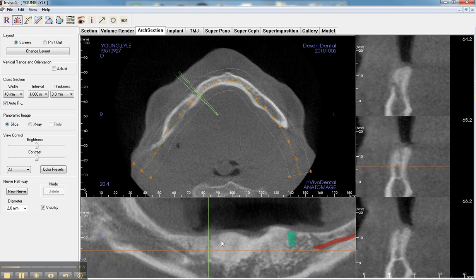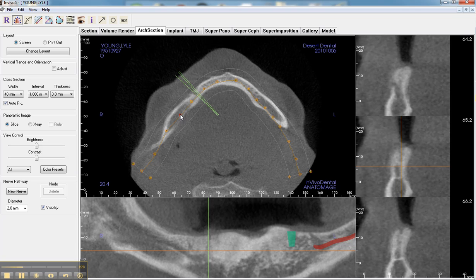And also the panoramic view. The benefit of having the panoramic view is that it's a one-to-one ratio. As we begin to move these little dots here, you can see that the nerve canal either appears or disappears. So we're actually defining the ratio of the slices right here.